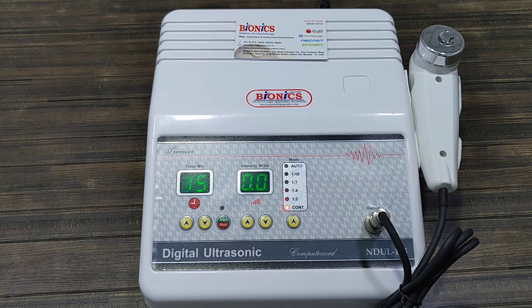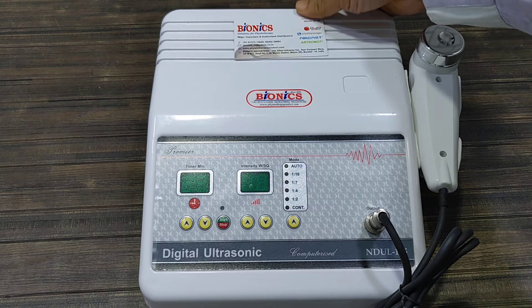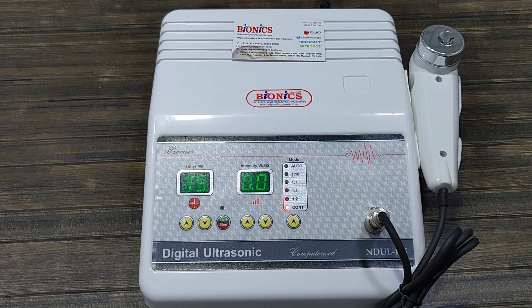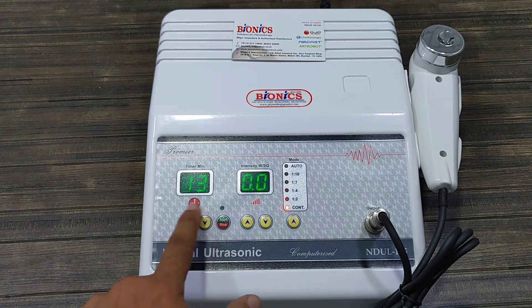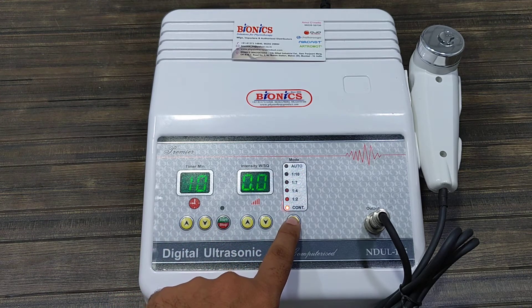Bionics innovation computerized ultrasound light model. On the backside there is an on/off switch so you can turn it on and off. It is very simple to operate — just set the treatment time as per your need, then you can select the mode.